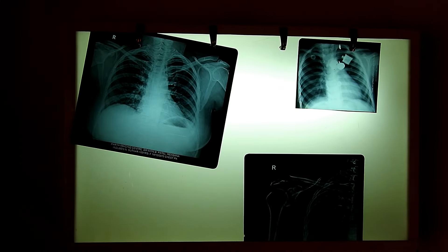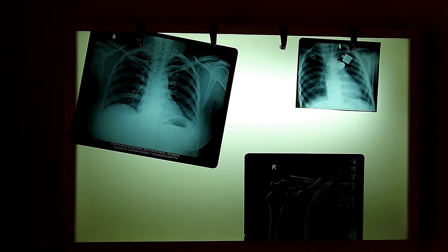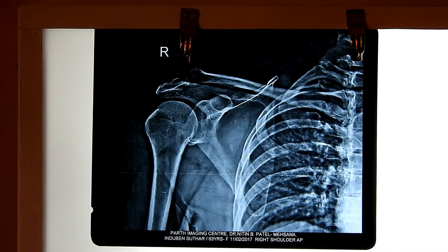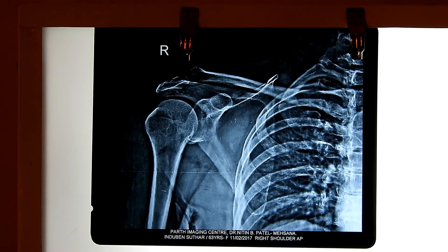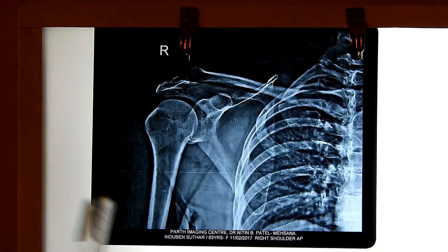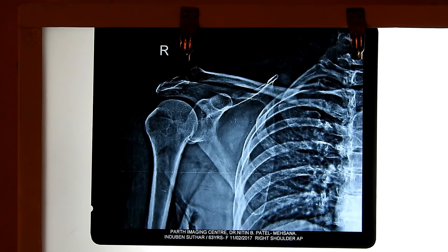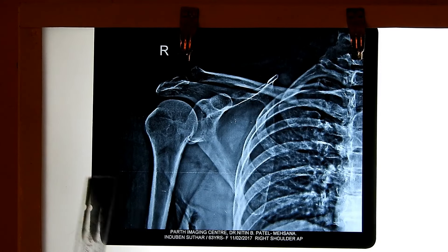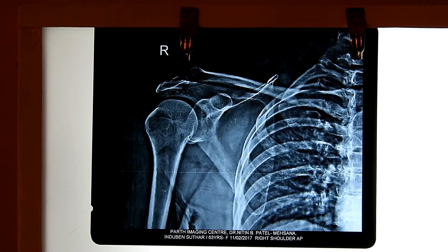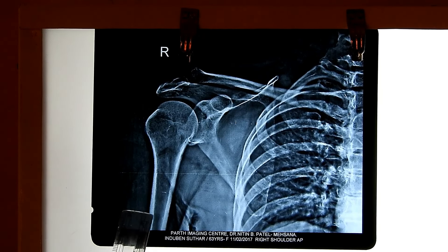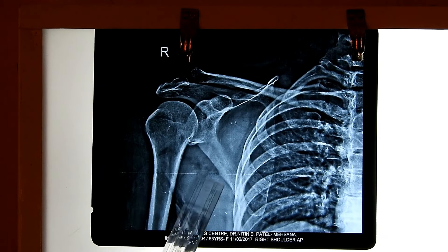That is all about how to read the radiological film. Now we will see the X-ray of the upper limb, starting with the shoulder region. For this X-ray, first you describe the type — for upper limb, mostly we take a plain type. Second, describe the view — it is an anteroposterior (AP) view. Third, the region — it is of the shoulder region. Fourth, the side — it is the right side. So it is a plain type, AP view of the right shoulder region.